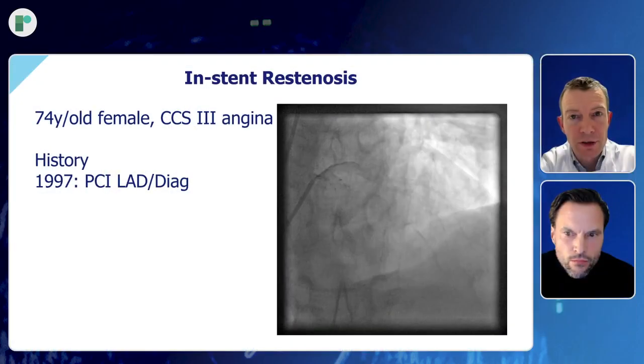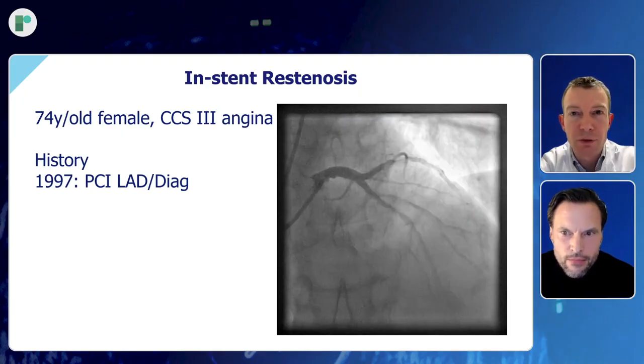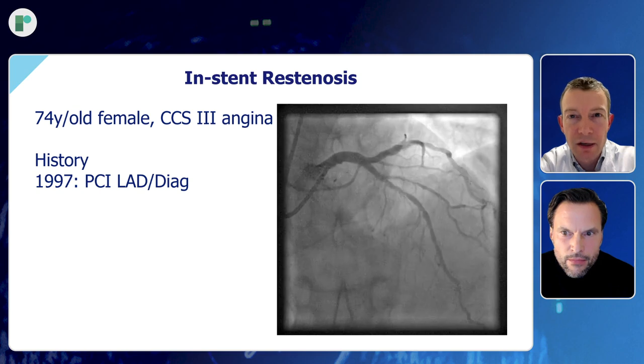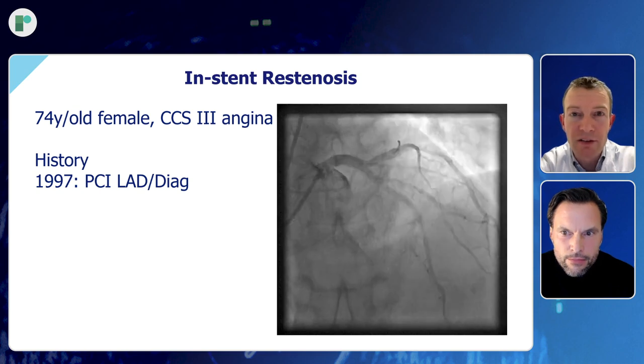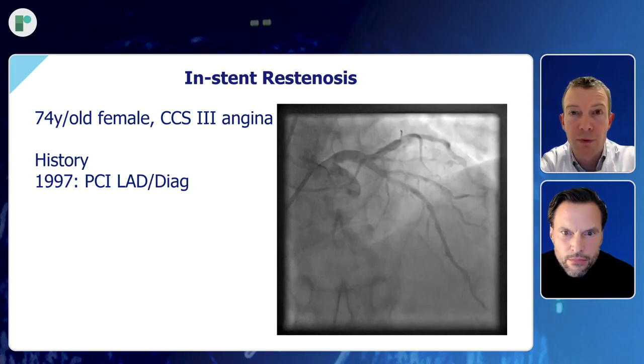And I think you have another interesting case. Those were beautiful examples, Christoph. And I think what is also very intriguing, and specifically about virtually all of the cases that you presented, is that this shows you that IVUS should not just be used to guide PCI. It's also a tool that plays a tremendously important role in the workup of coronary artery disease.